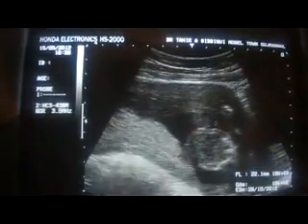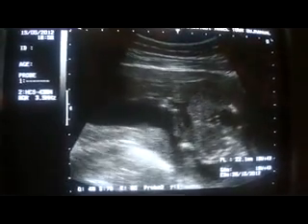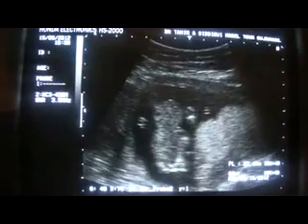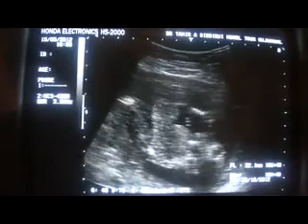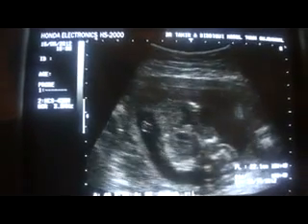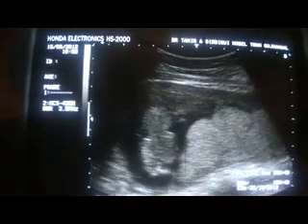Here you can see this clearly. The vessel is entering into this part. This is the outgrowth, and this is the anterior abdominal wall. This is the posterior abdominal wall. This is the anterior abdominal wall, and this is the outpouching becoming continuous with it in this region. So we cannot take the transverse section of the fetus, and the weight cannot be calculated.